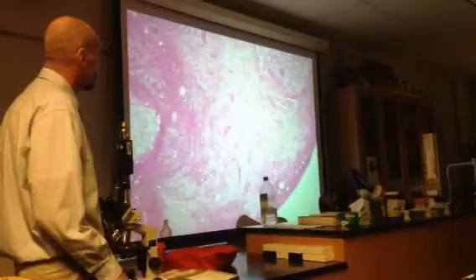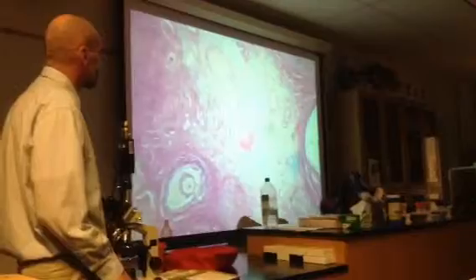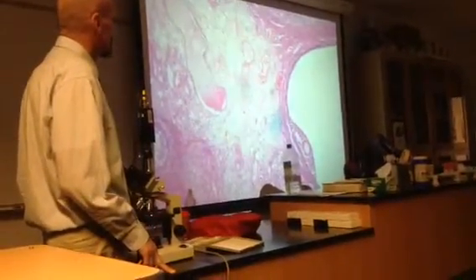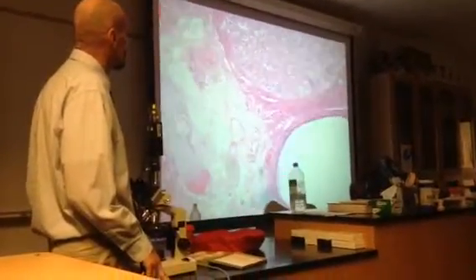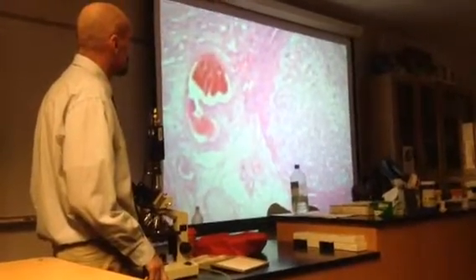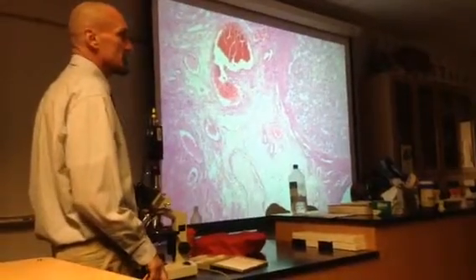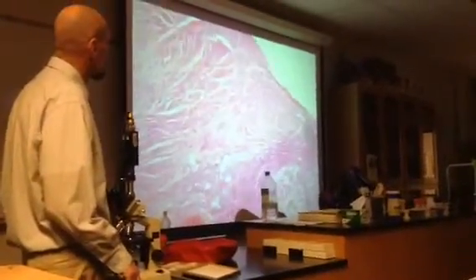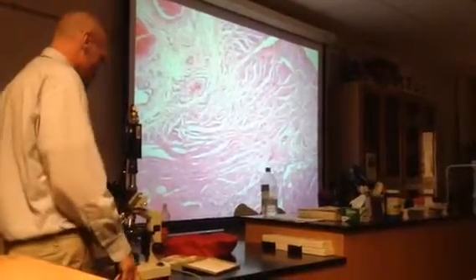What was, like, if you go back up out of that middle, one of those other white spaces, like the big one? I don't know exactly. Could be blood vessels possibly. That one there looks like a blood vessel right there. Could just be the way that it's processing the slide in the blood. That's actually the mesovarium up there, but we didn't really dwell on that, so we won't at this point.